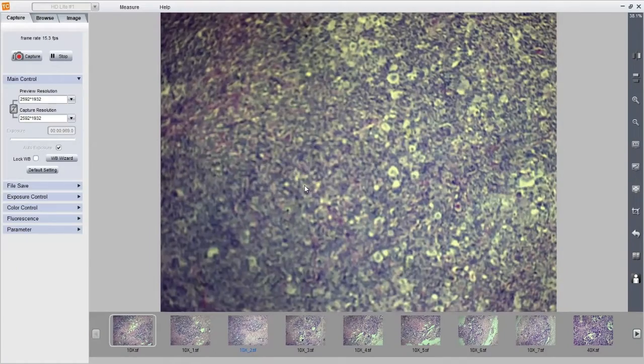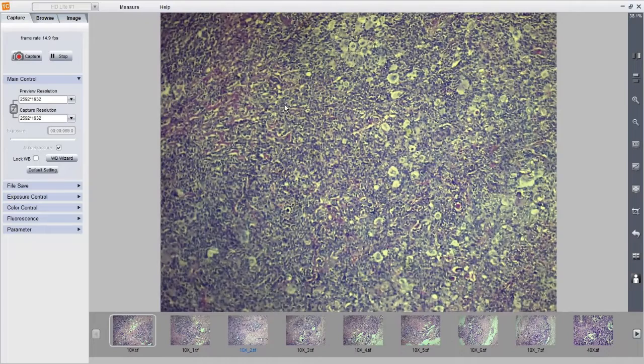So what do I see? This is my 10x. Again, the large cells are very conspicuous here. Some sort of lacunae, the lacunar cells. If you remember the lacunar cells that I showed you in the picture, this is exactly similar to those cells. We can see these tumor cells with prominent nucleoli. What about this background? The background has very small reactive lymphoid cells, and then the sheets of these large cells.